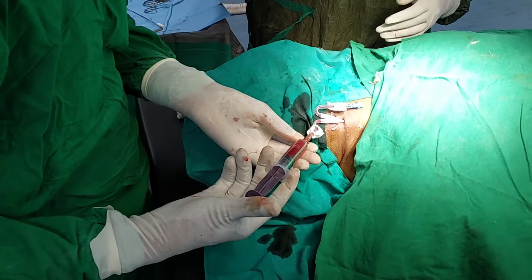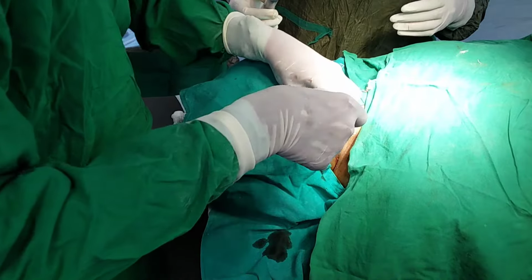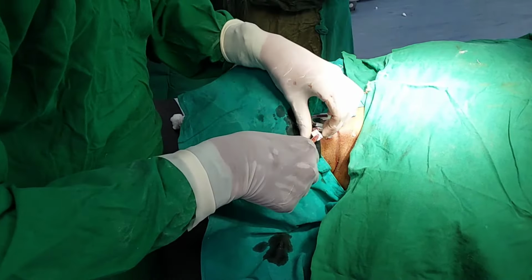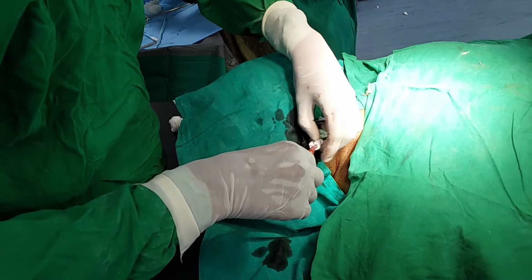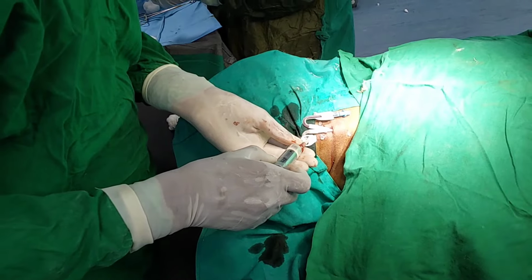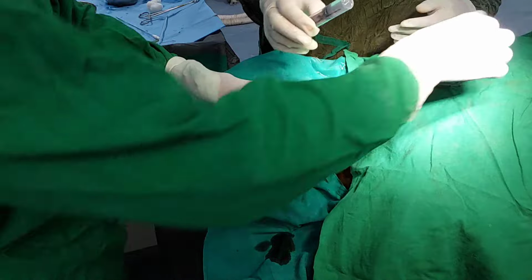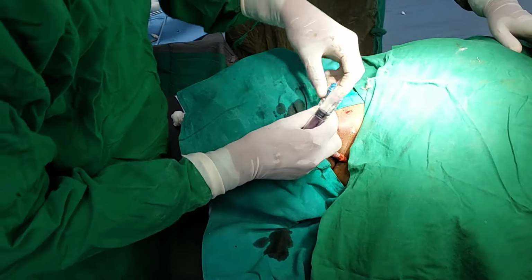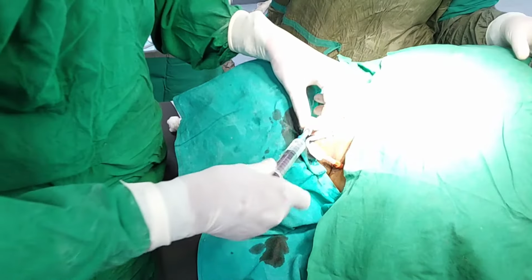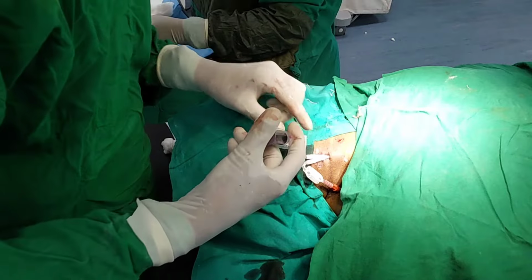And always remember, push the normal saline in a vertical manner so that air will not go inside the lumen. While aspirating, you can aspirate in a horizontal position, but while pushing it should be in a vertical manner, and never push the solution completely, so air will not go inside. It will remain in the syringe. See, this blue color lumen is also patent.